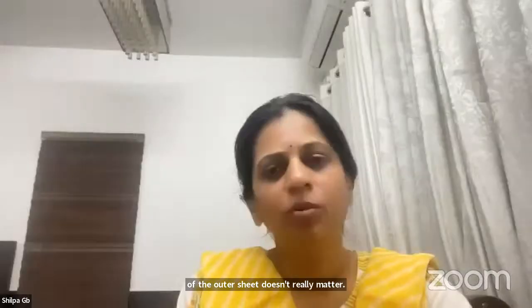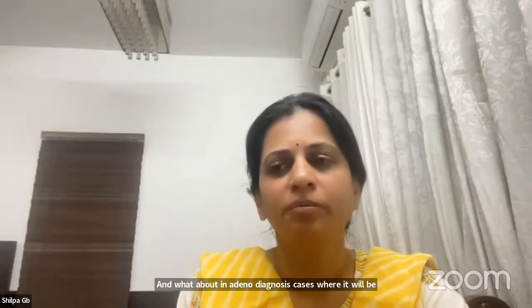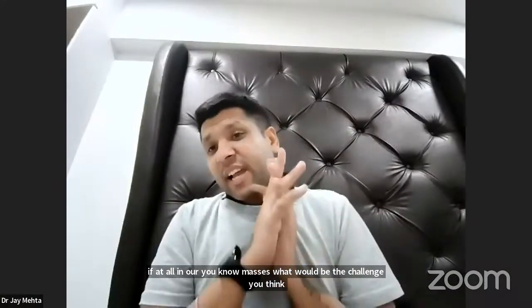And what about adenomyosis cases, where it will be difficult to locate the endometrium, and anyway you don't do it under ultrasound guidance? If at all in adenomyosis, what would be the challenge you think? I think one of the challenges in adenomyosis is not location, it is the length of that shaft which goes inside the cervix.